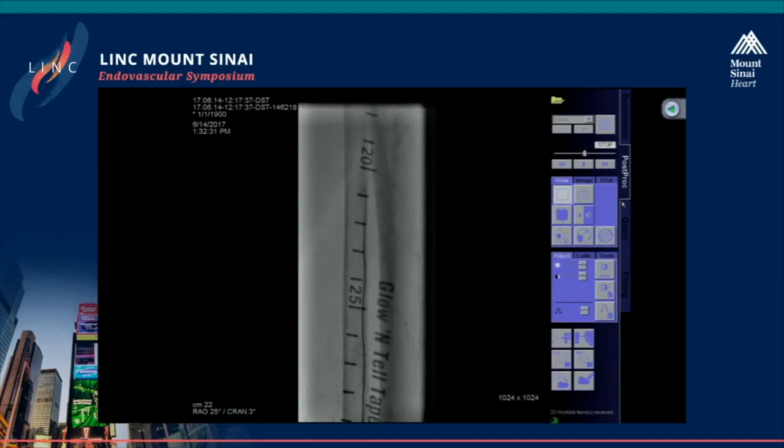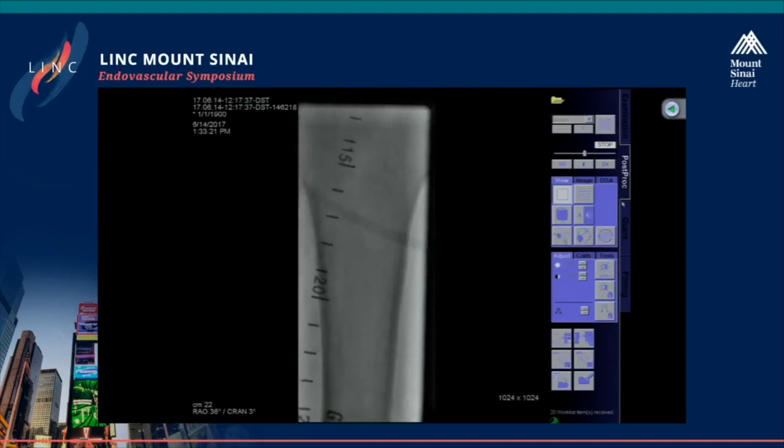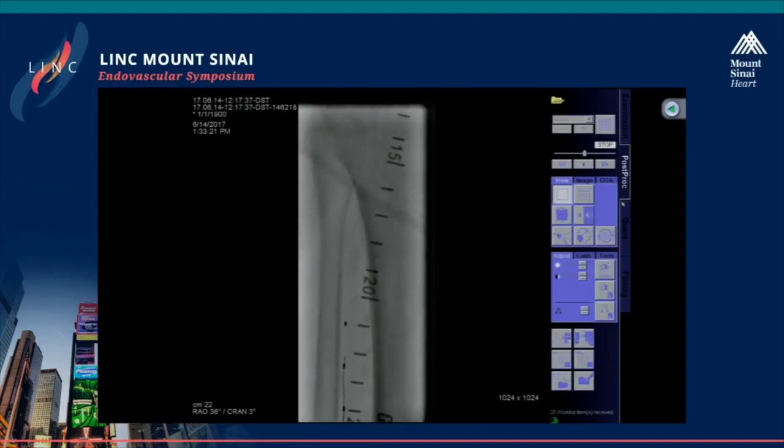Track it now. Hold it. Wait, hold on. Yeah, hold it. Hold the wire straight. Okay. We're going to track it up. Okay, hold it. No. All right, track. So I think we were able to get through so far above. Okay, come down below now. Show me above. Show me above, Ray. Ray, a little puff.